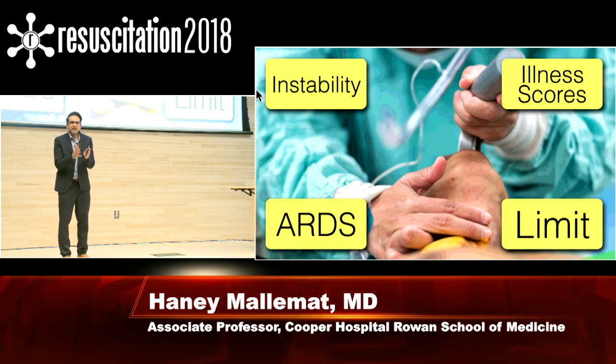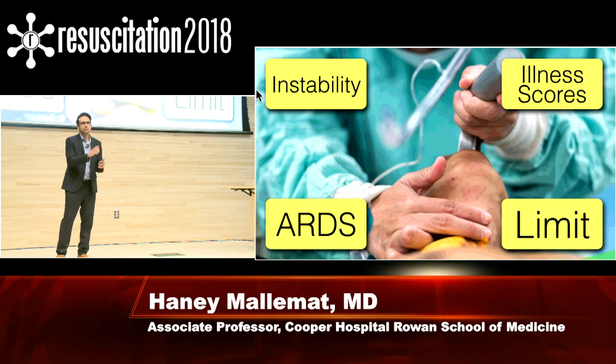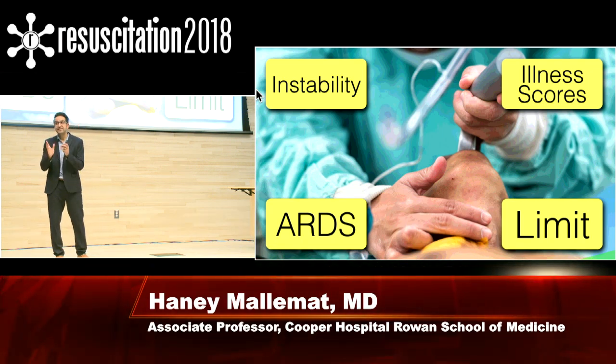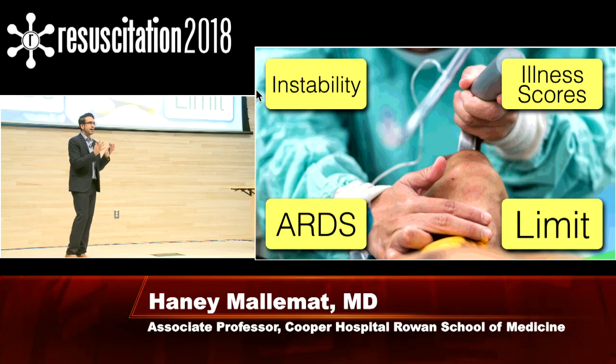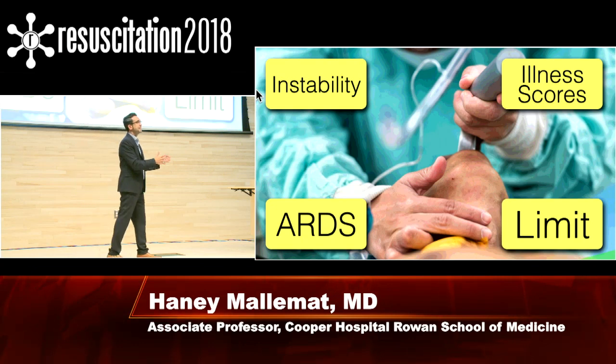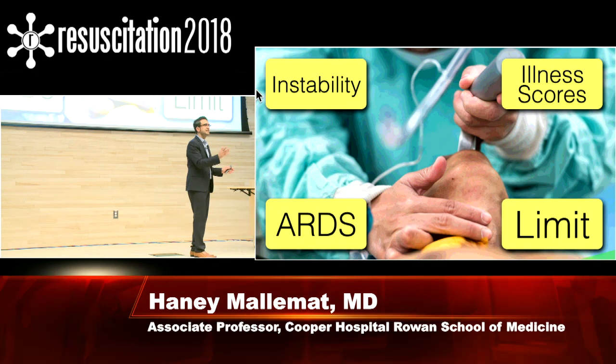But I know in that 45 minutes, I am going to go maximal with my settings, with my diuretics. I'm going to crank things up. And if at the end of that 45 minutes, that person's still not doing better, then it's time to tube them. But I think it's important that for every patient that you see, you set some time limit to say, if I maximize everything, enough is enough. It's time to intubate them.